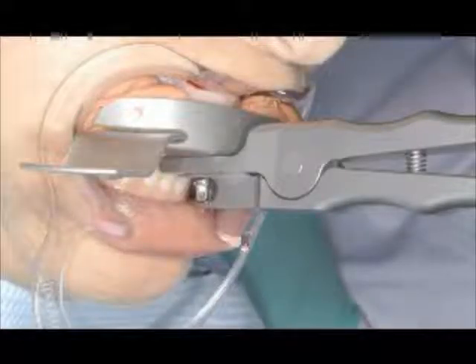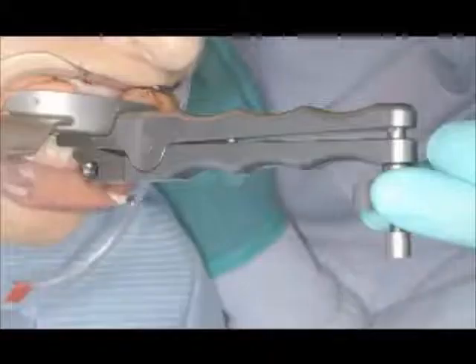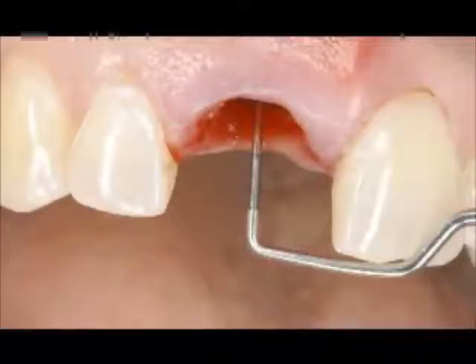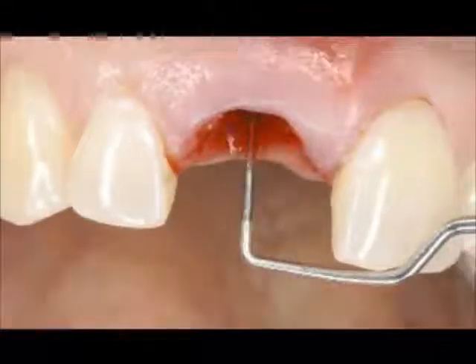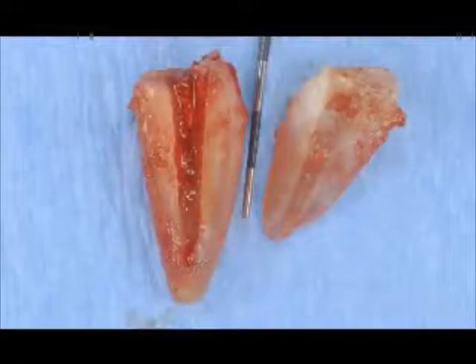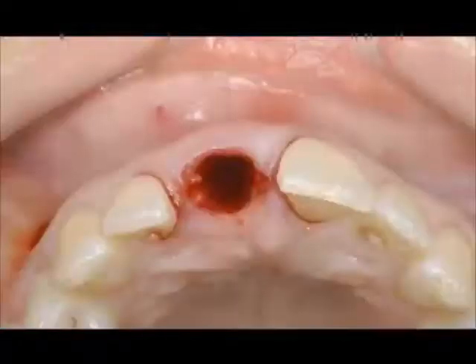This is actually a screw-based system so that all the force is being applied through this system coronally and vertically, and this is what the site looks like approximately 5 minutes later. We simply extracted the tooth without any pressure laterally or on the buccal plate of bone. This is the tooth that was fractured being removed, and you can see how that extraction screw was able to engage the fractured segments and remove it without trauma.